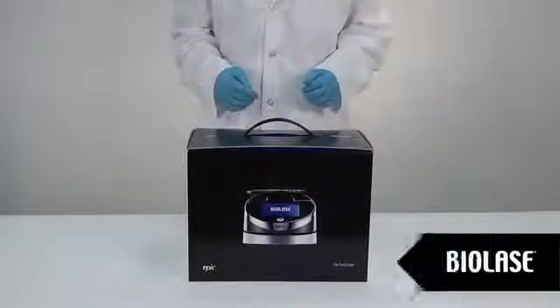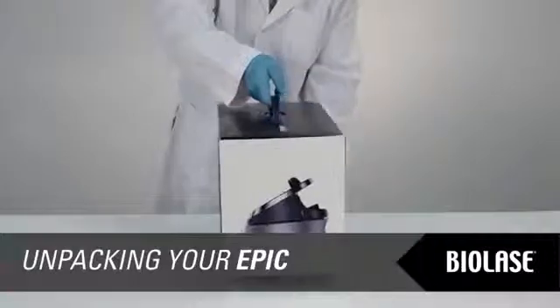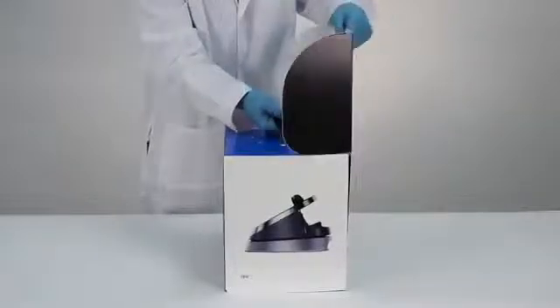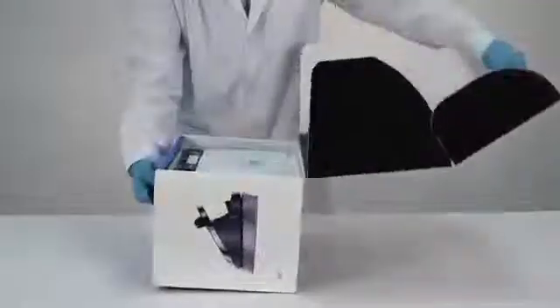Your EPIC system is shipped inside a convenient carry case for easy transportation. To open the EPIC packaging, set the box with the handle up and lift the flap. As you lift the flap, grab the handle and tilt the package forward to access the EPIC and all accessories as shown.